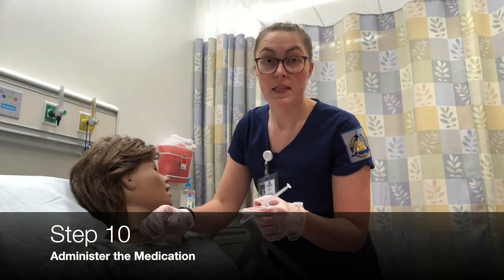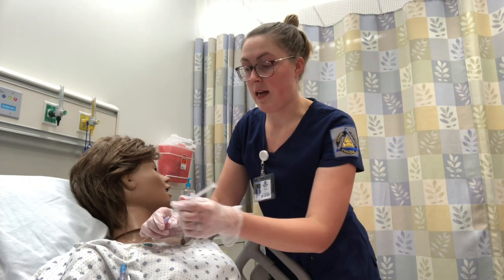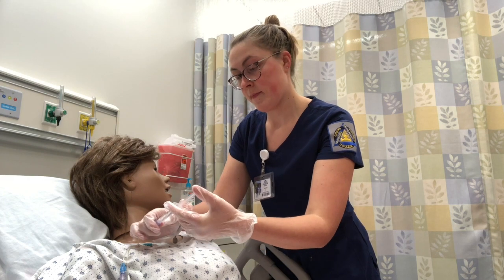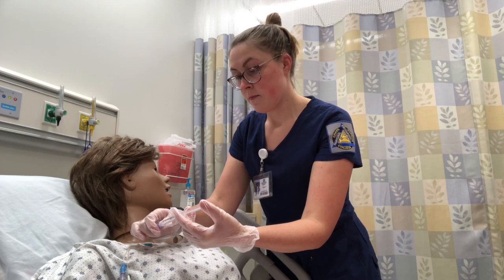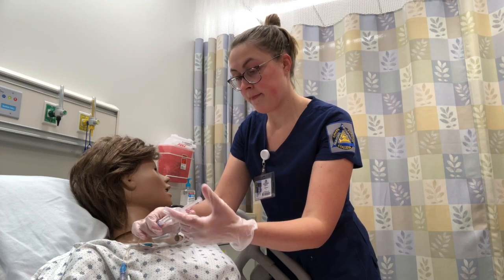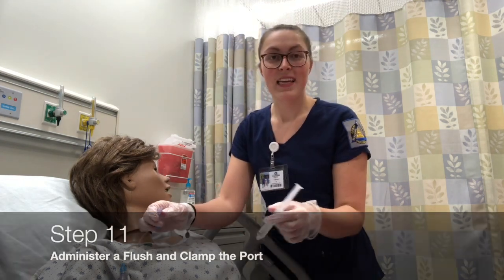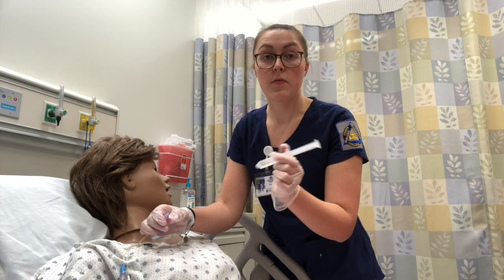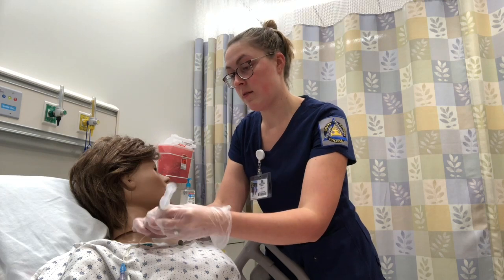Lasix or furosemide should be given 20 milligrams per minute. Therefore, I'll be giving 30 milligrams over 1 minute and a half. It's been 1 minute and a half. Now that I've pushed the 30 milligrams of IV Lasix, I will now conclude with another 10 milliliters of sodium chloride to flush.